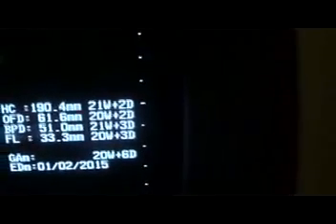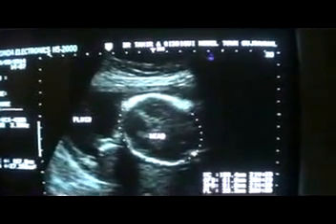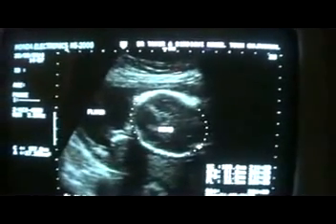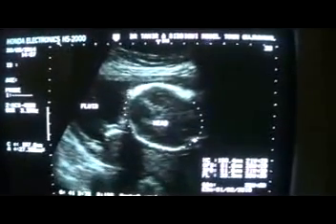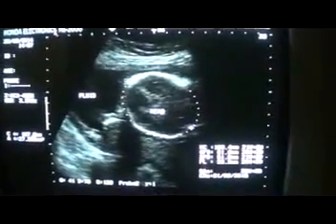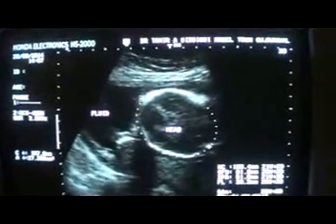Gestational age is 20 weeks, and this is important because in breech presentation, the head circumference, the biparietal diameter is at times not accurate, and however, occipitofrontal diameter is usually persistent or consistent with the gestational age. Abdominal circumference, though, and the weight cannot be determined because of fetal ascites and protuberant abdomen. So this is essential in this scan. Thank you.